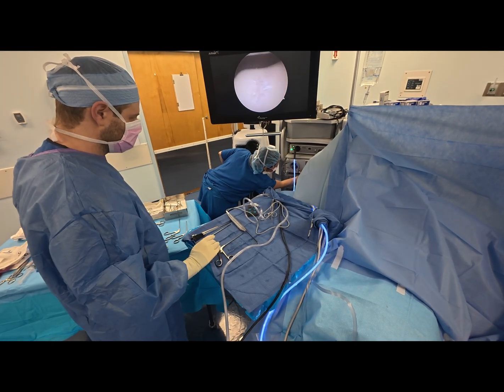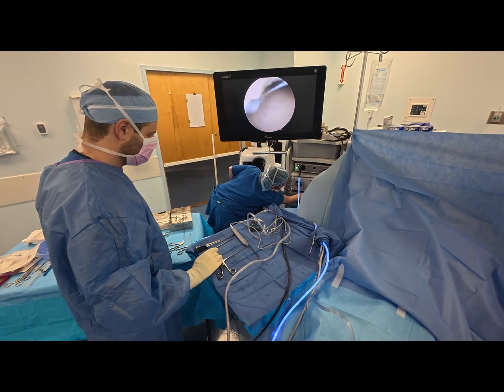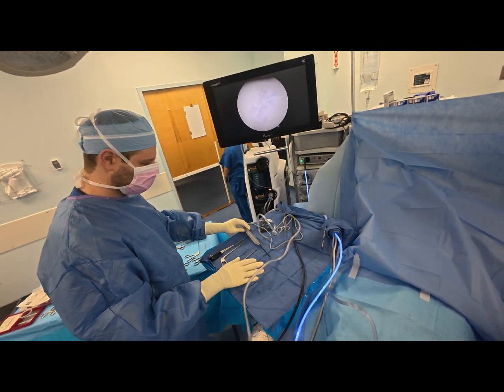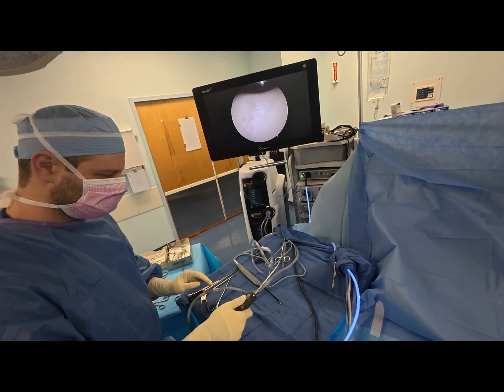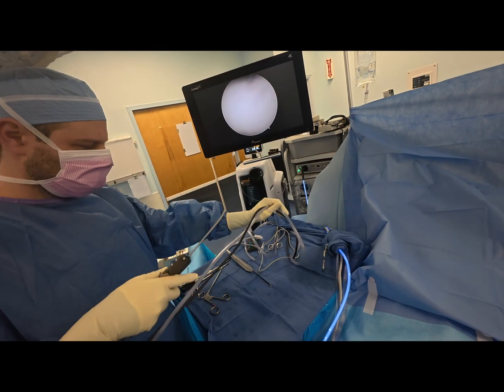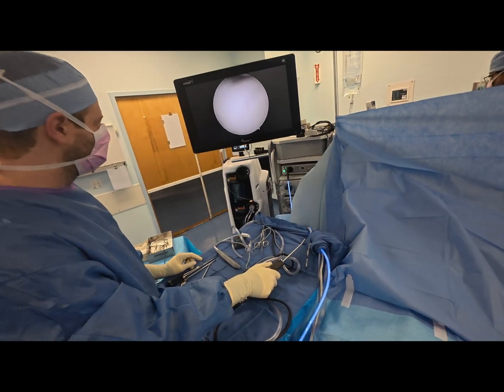So that may cause some pain in the front of his knee, right there. That's the trochlea of the distal femur. And the kneecap articulates with that. And you can see it, but again, it's a very small lesion. For the most part, he's got a beautiful looking knee. And we're done.